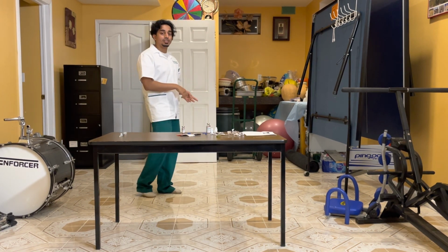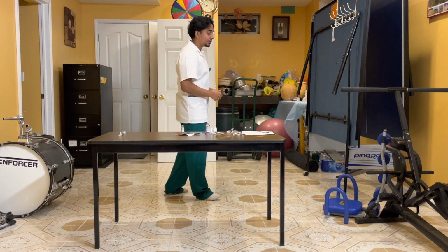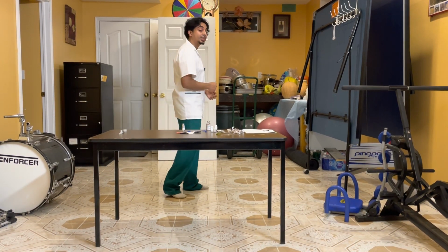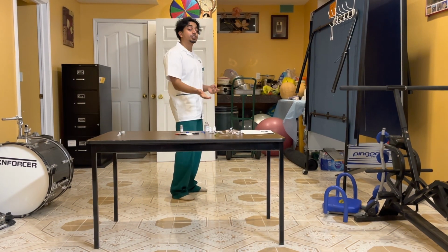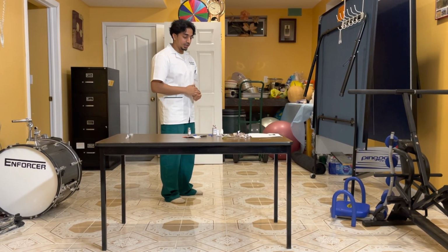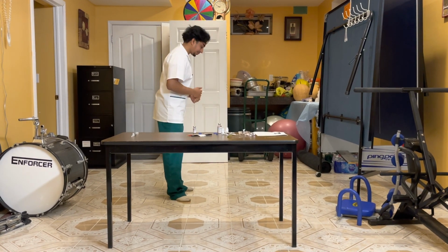Now that I'm back in the room, I introduced myself, I did proper hand hygiene, I introduced who I was, I did 2 patient identification indicators, which is the name and date of birth. I have the right patient. Now I assess. The first thing I do is I tell the patient what procedure we're doing. I tell the patient the purpose of the medication, the action of it, as well as the side effects.